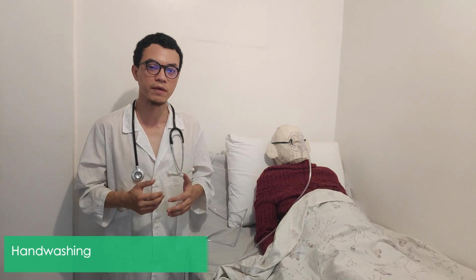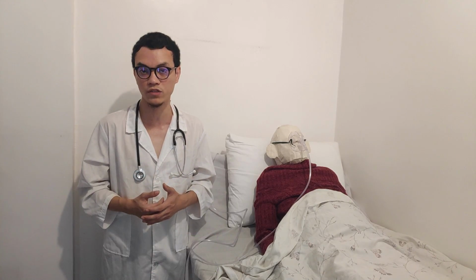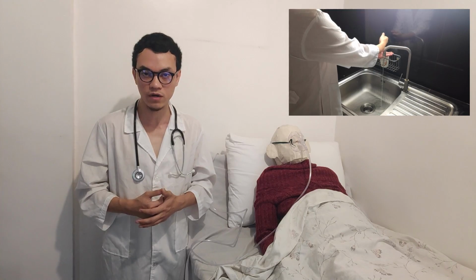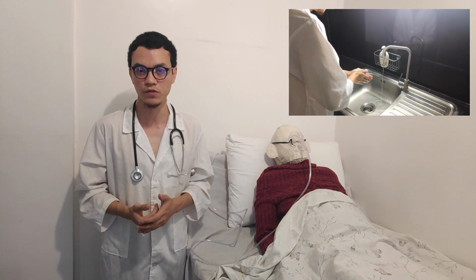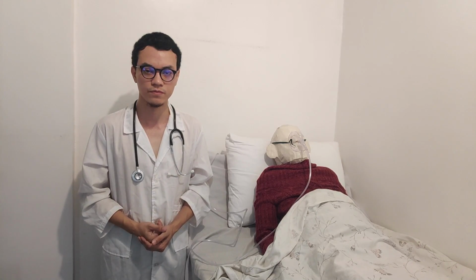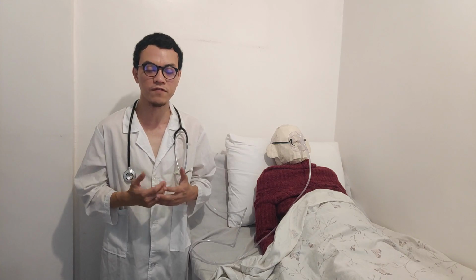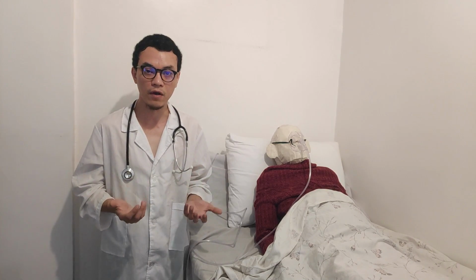Next is remove PPE if used and perform hand washing. Again, hand washing prevents transmission of microorganisms and bacteria from one person to another. Next is remove the face mask and dry the skin every 2 to 3 hours if the oxygen is running continuously. Do not put any powder around the mask.